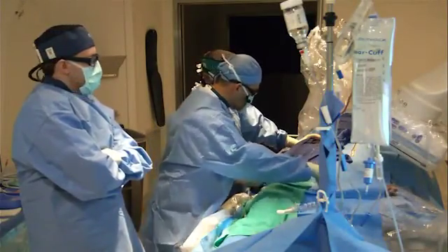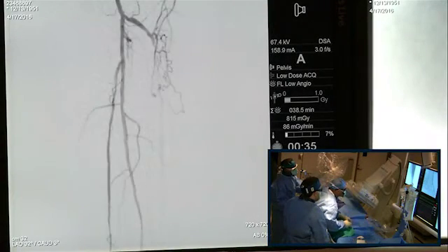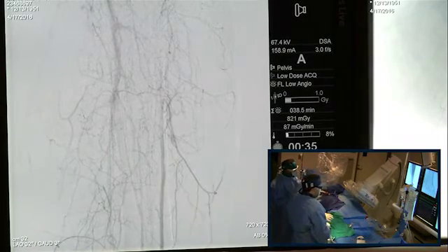Yeah, let me give you a picture. Dr. Manzi mentioned, please also focus at the origin of the SFA, at the very proximal segment. There seemed to be some disease there, which was not very clear, at least on the angiograms we looked at here. Absolutely right, he's absolutely right. And we need to address that with the DCB all the way to the ostium. Very nice. And here's the picture. You're keeping it up 3 minutes, I'm guessing? About a minute and a half.